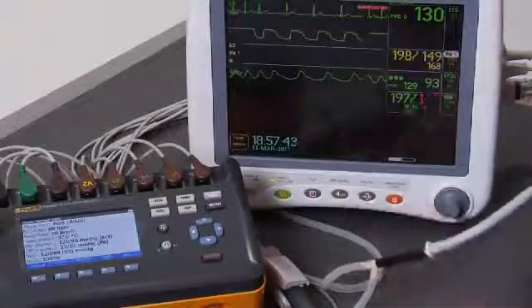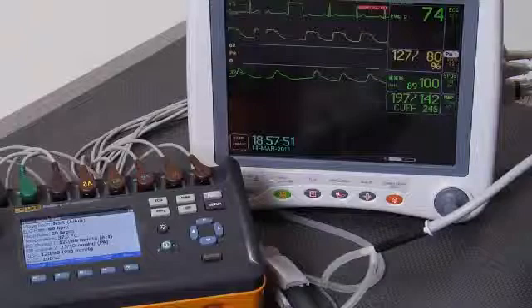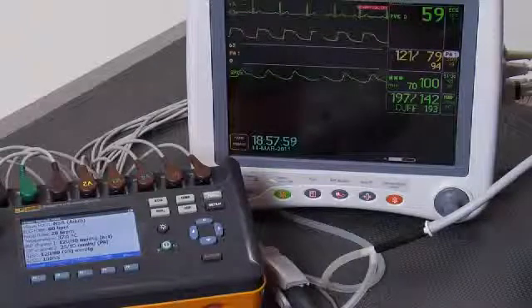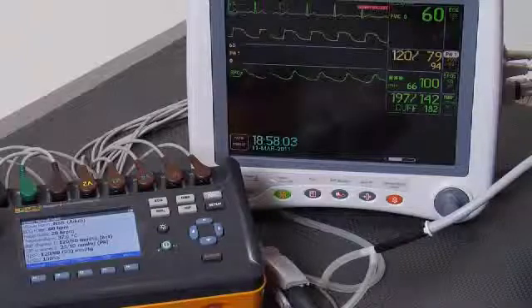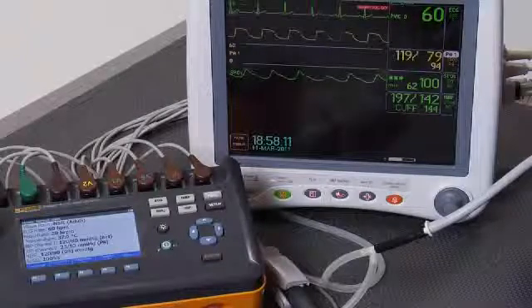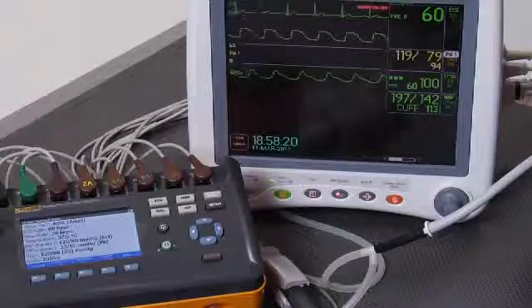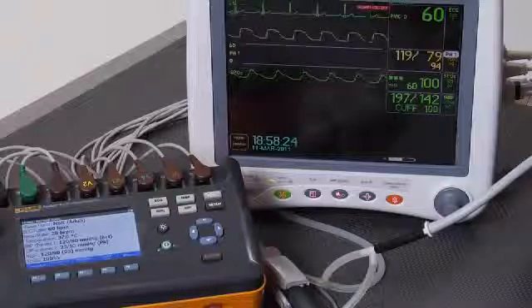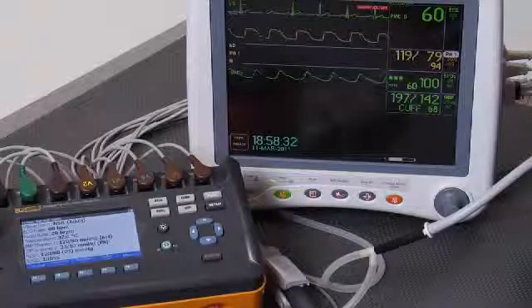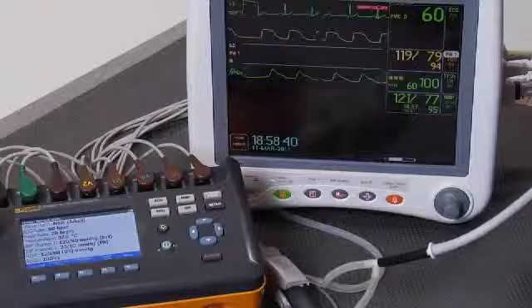The normal simulation includes an ECG rate of 60 beats per minute, a respiratory rate of 20 breaths per minute, invasive blood pressure of 120 over 80, a cuff blood pressure of 120 over 80 with a mean of 93, and SpO2 at 100% O2 sat. As you can see, the patient monitor is already displaying 60 beats per minute for heart rate. It's gotten 119 over 79 with a mean of 93 for invasive blood pressure, and the cuff is making its NIBP measurement now. O2 sat is 100%. Cuff reads 121 over 77 versus 120 over 80 — pretty good.